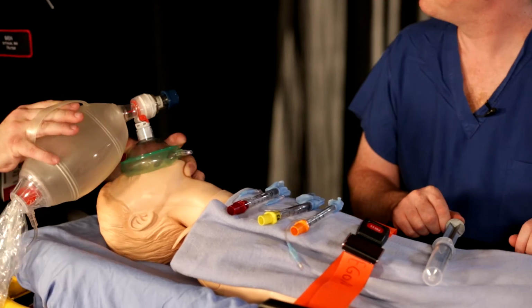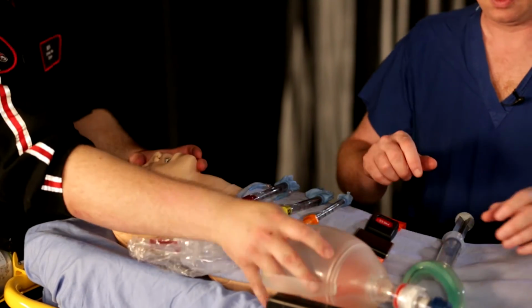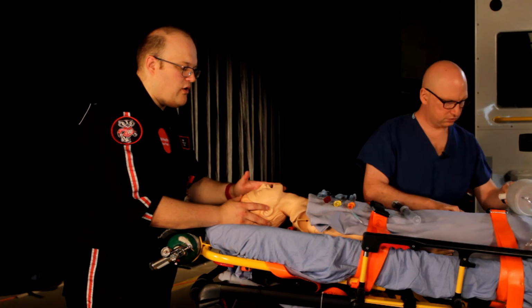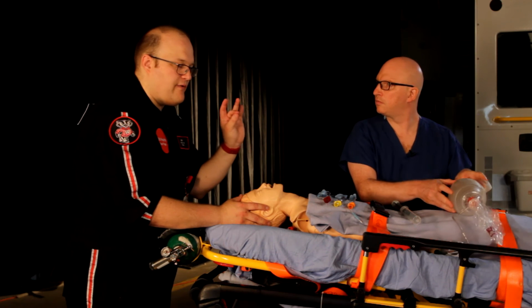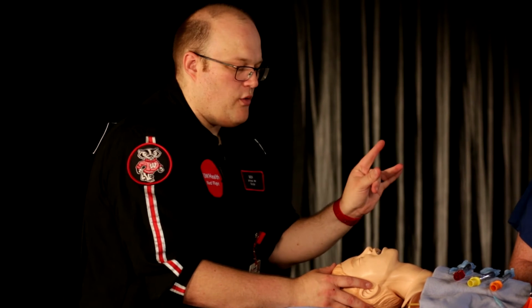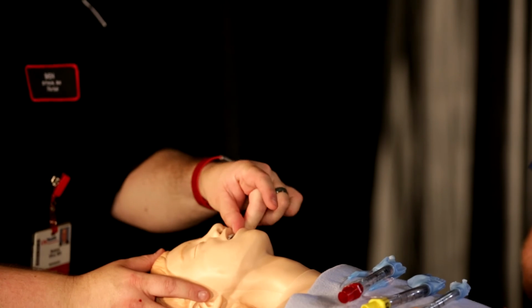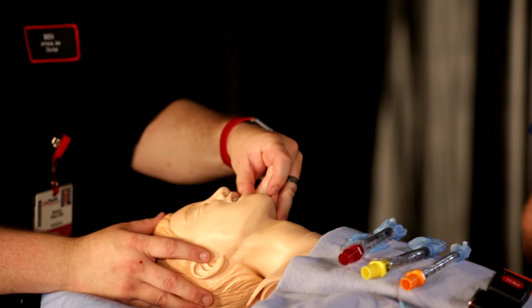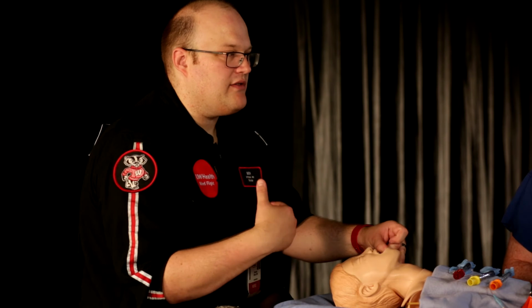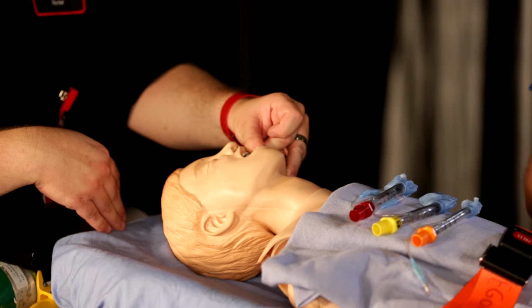Okay. Yep. So then what I'm going to do is I'm going to take the bag mask, set it aside. Dr. Kohler is going to bag for me once I get the tube in. I'll be ready. I want to make sure I open the airway, and what I'm going to use is my fingers, so my thumb and my middle finger are going to extend like that and open the airway. You want to make sure the child is nice and asleep, because if I do this in an awake child, I will be bitten, and you cannot put a King airway, an i-gel, or anything into the oropharynx of a child who's awake.